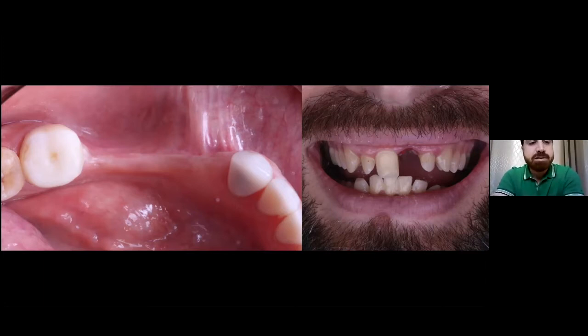In these two cases, the first one is in the posterior mandible, and the second one is in the aesthetic zone. And in both cases, what is common is the lack of bone. So what is important to know is that when you're working in a private practice, you have to make things easy, and you have to simplify your surgeries in a predictable way. And this is what we're going to cover today. And with the help of tent poles, as you're going to see in the presentation, it's going to be an additive tool in your drawers.